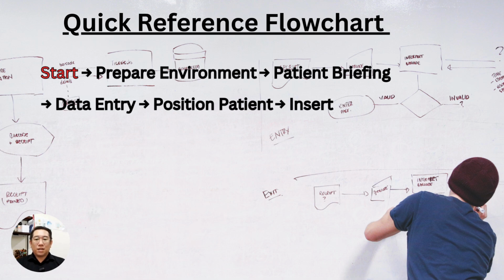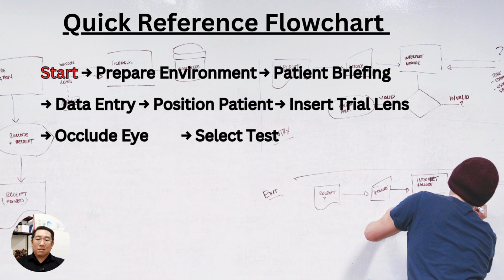Then, insert trial lens if needed. Next, occlude eye. Cover the non-tested eye. Next will be select test. Select the appropriate test sequence. Then proceed to run test.